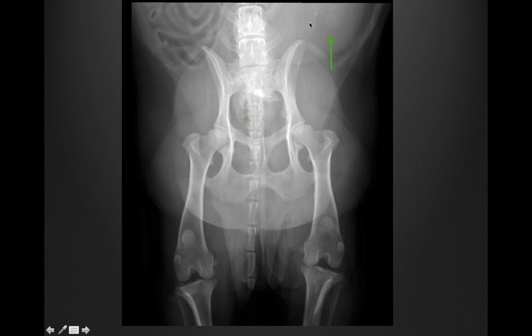As you see the urinary bladder displaced off to the side, these mineralized foci are clearly within the urinary bladder. This dog does have cystic calculi, or at least mineralized urinary bladder debris.